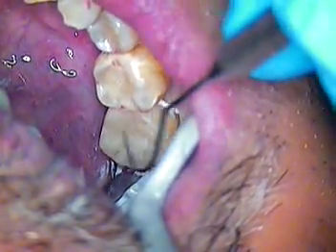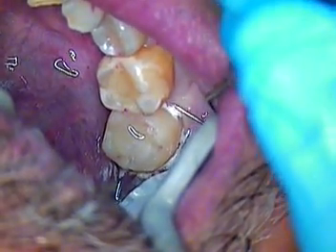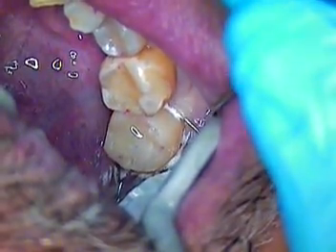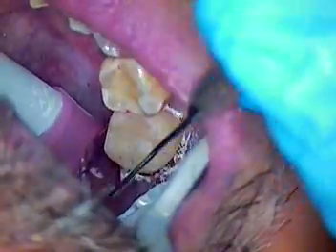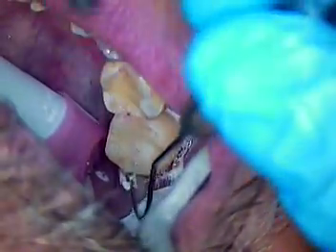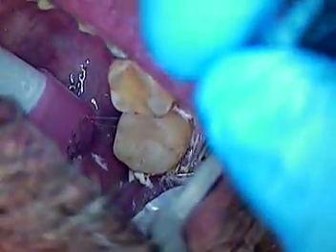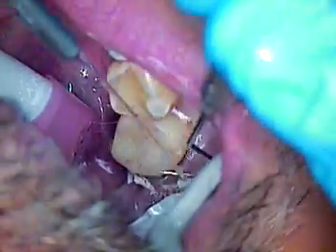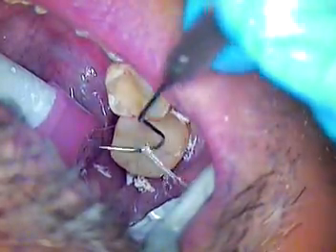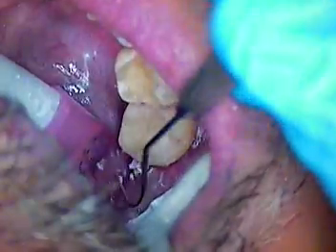What we'll do first is introduce water. I usually do that first, and that will make it separate from the tissue nicely and also helps to speed up the set of the material. Just starting, we'll go nice and easy with the cleanup. It's still a little stringy. You can see it likes to stick to even soft tissue — it has an affinity for just about any surface.